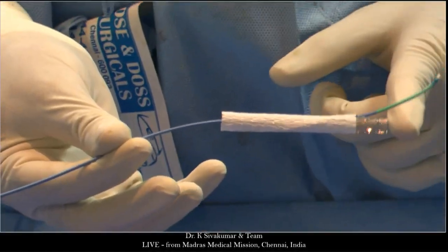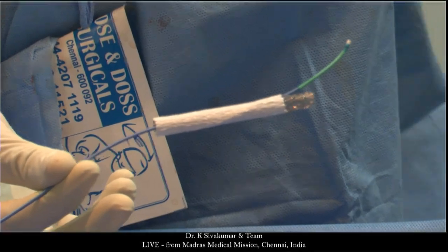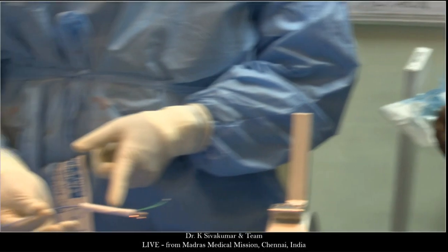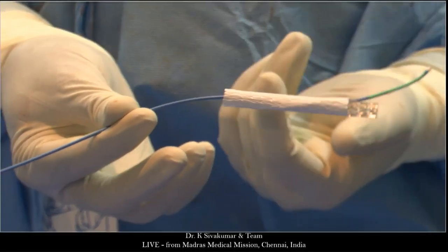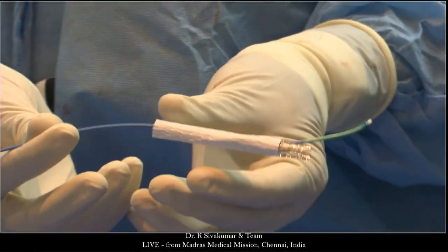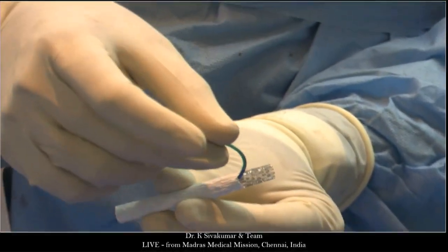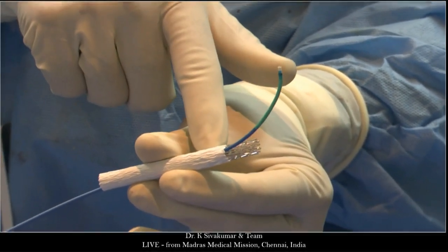So this is a stent which has got two components. The last 15 millimeter, the stent is made by Zephyr. Turn around. So this stent is Zephyr. This is an Indian made stent. It's a cobalt chromium stent. So this stent has got an 8 centimeter length. 65 millimeter is covered, 15 millimeter is uncovered. We have got a guide catheter coursing through the lowermost strut. I have taken it through the lowermost strut of the uncovered part, and this is the covered part.